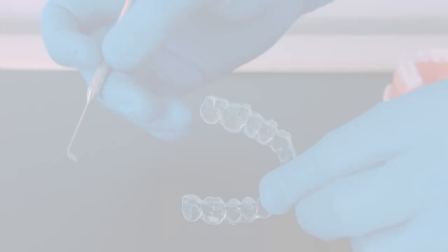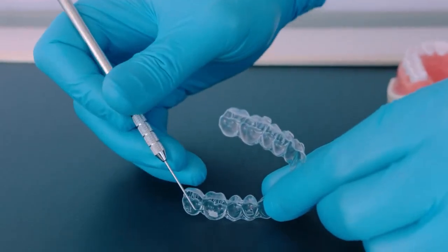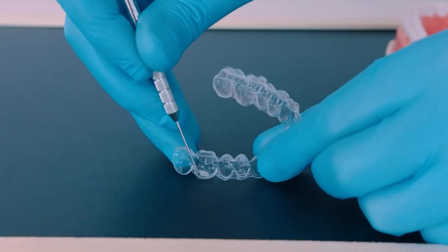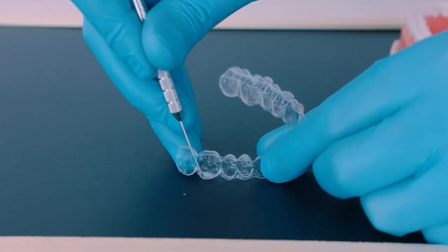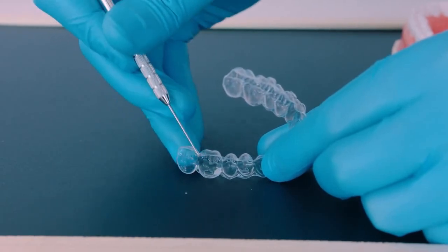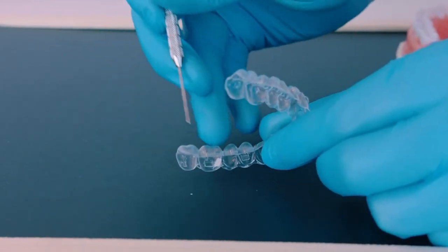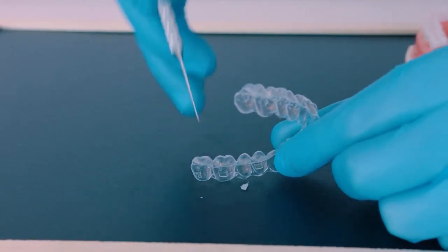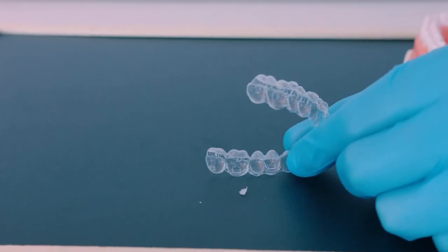If an attachment completely detaches during template removal, no need to worry. You can simply remove the composite within the pocket and repeat the procedure using the same template. Additionally, if one attachment debonds during treatment, you can reattach it using the current aligner step as a template after ensuring the fit is perfect.